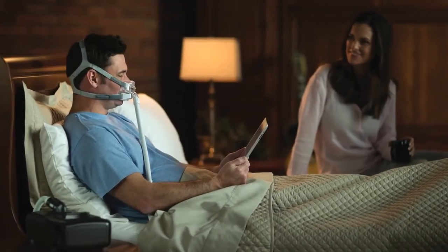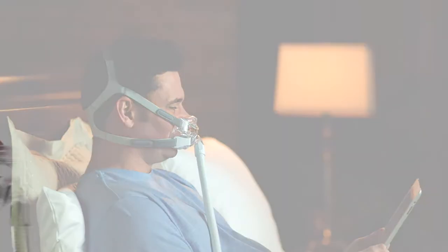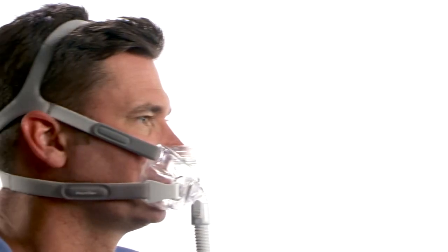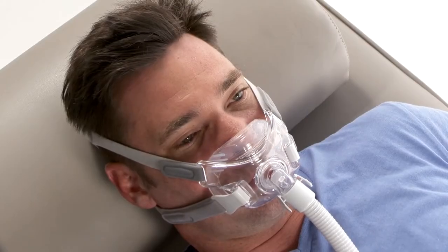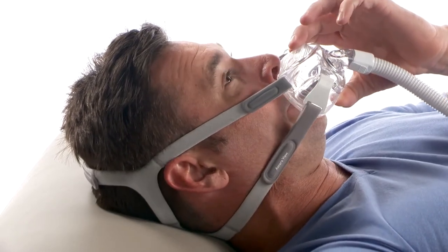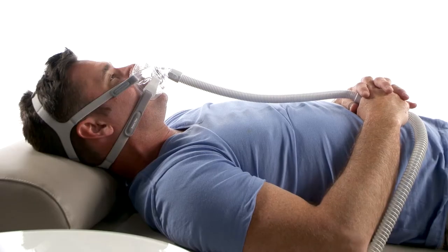Amara View is an innovative full face mask providing therapy through the mouth and nose while minimizing face contact. It should fit comfortably under the nose and against the face without significant air leaks. If you experience a leak, reseat the mask by pulling it directly away from your face, then gently setting it back into place. This may be all that is necessary to achieve a good seal.